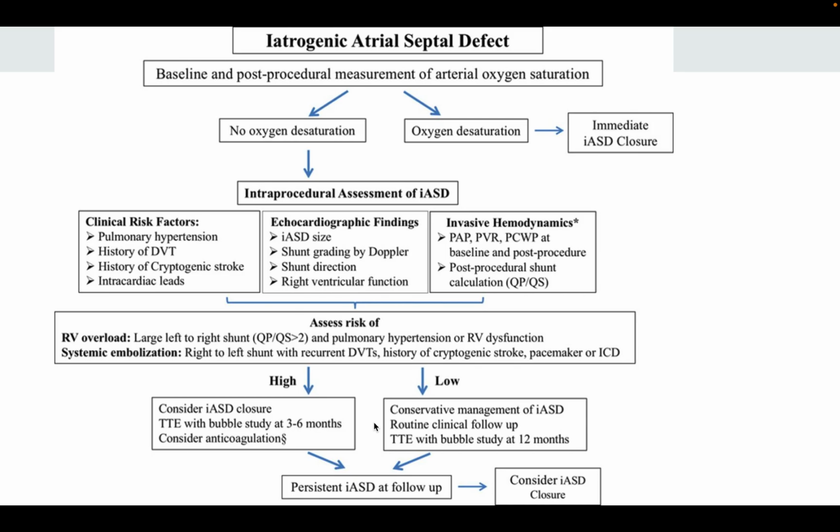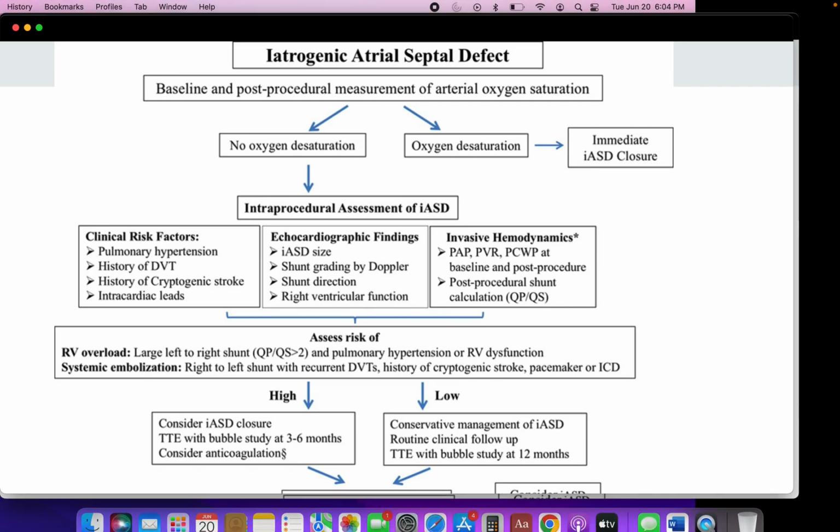And so this can help guide, but ultimately it comes down to a risk-benefit conversation with the intraoperative team and the proceduralist, and also the surgeon if it's involved that he needs to close it. That's all I have.